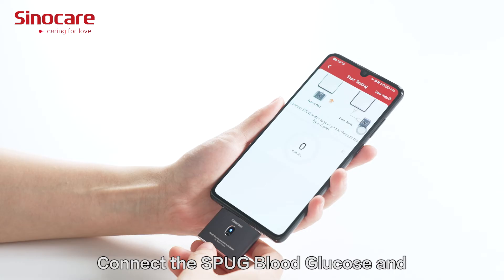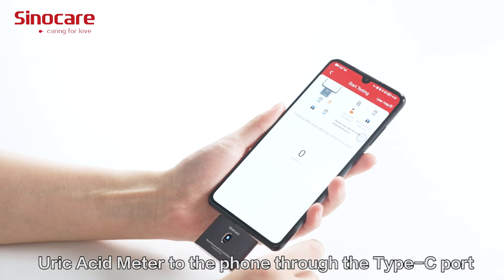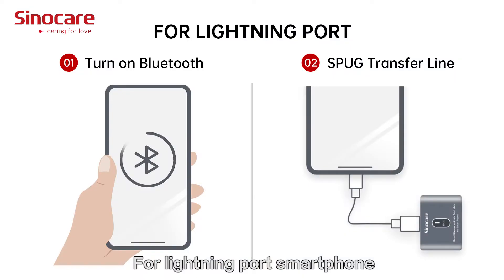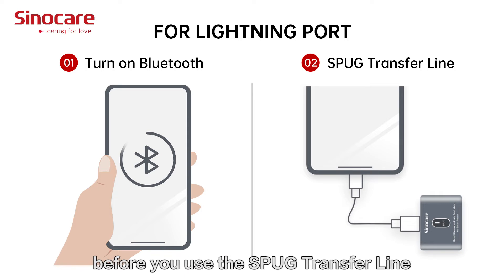Connect the SPUG Blood Glucose and Uric Acid Meter to the phone through the Type-C port. For lightning port smartphones, please turn on Bluetooth on your phone before using the SPUG Transfer Line.